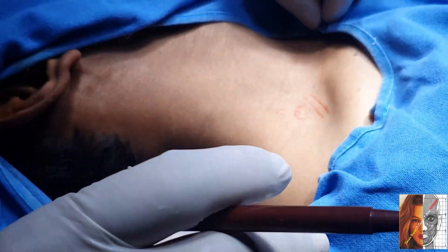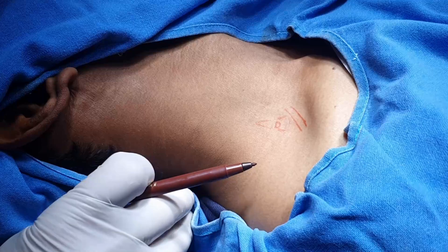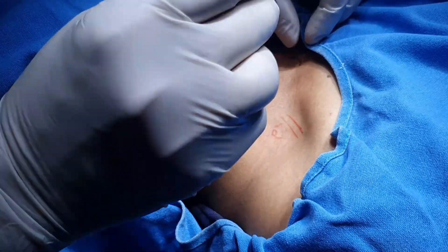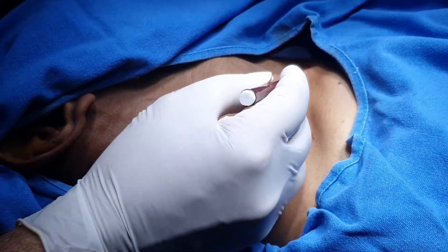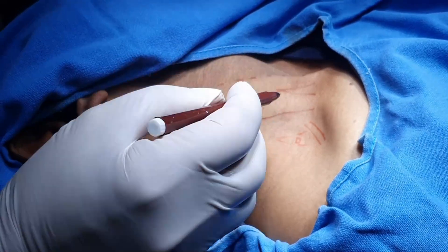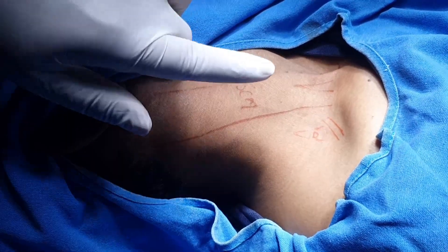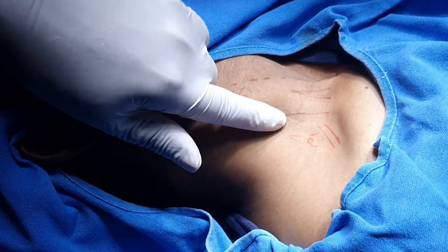In this patient I am giving a brachial plexus block, so let me explain some basic anatomy. This is the suprasternal notch and you can notice the sternocleidomastoid muscle — these are the two heads of the sternocleidomastoid. If I put the finger over the sternocleidomastoid and roll it laterally from here, you just roll it laterally.